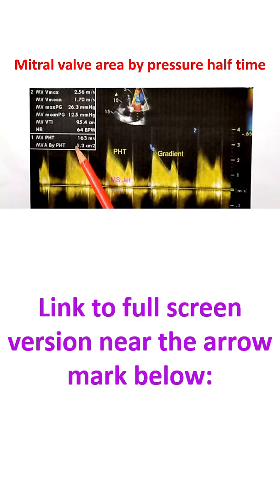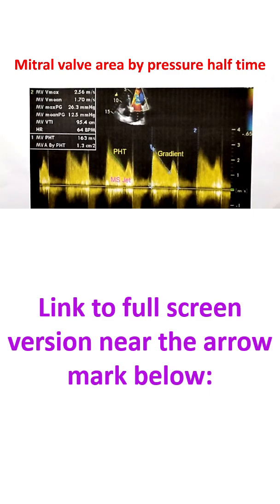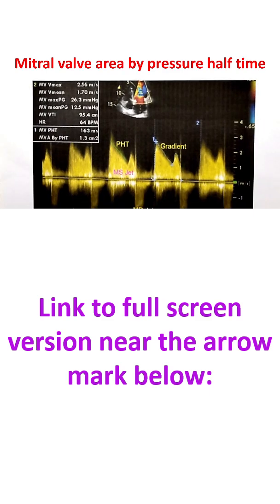Here the measured pressure half time is 163 ms and the corresponding mitral valve area calculated by the machine is 1.3 square cm. A pressure half time of 220 ms corresponds to 1 square cm of mitral valve area. If you divide 220 by the observed pressure half time, you get the mitral valve area.